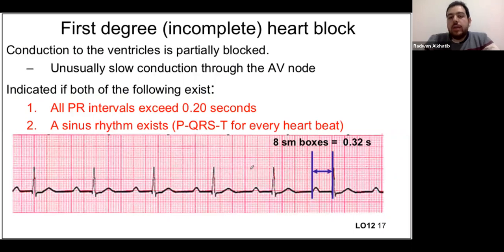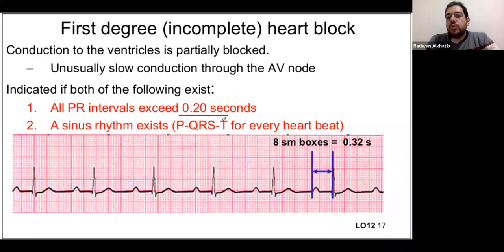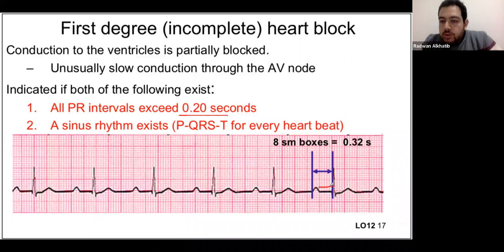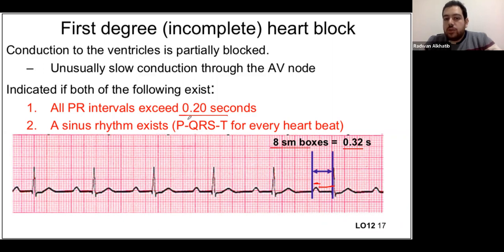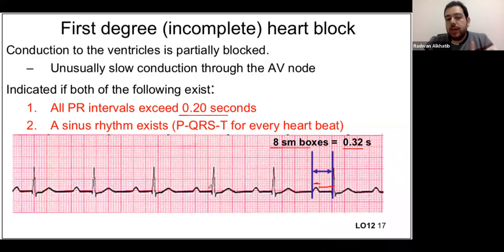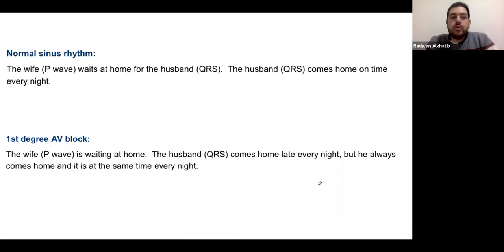First degree AV block: the AV node is only slightly dysfunctional. The PR interval exceeds 0.2 seconds — more than five small boxes or one big box. On the ECG shown, the PR interval is about 1.5 big boxes or 8 small boxes (0.32 seconds). By definition, every P wave is still followed by a QRS — no dropped beats. The PR interval is constantly prolonged by the same amount throughout the ECG. In the story: the husband always comes home, but always late, and always at the same late time.